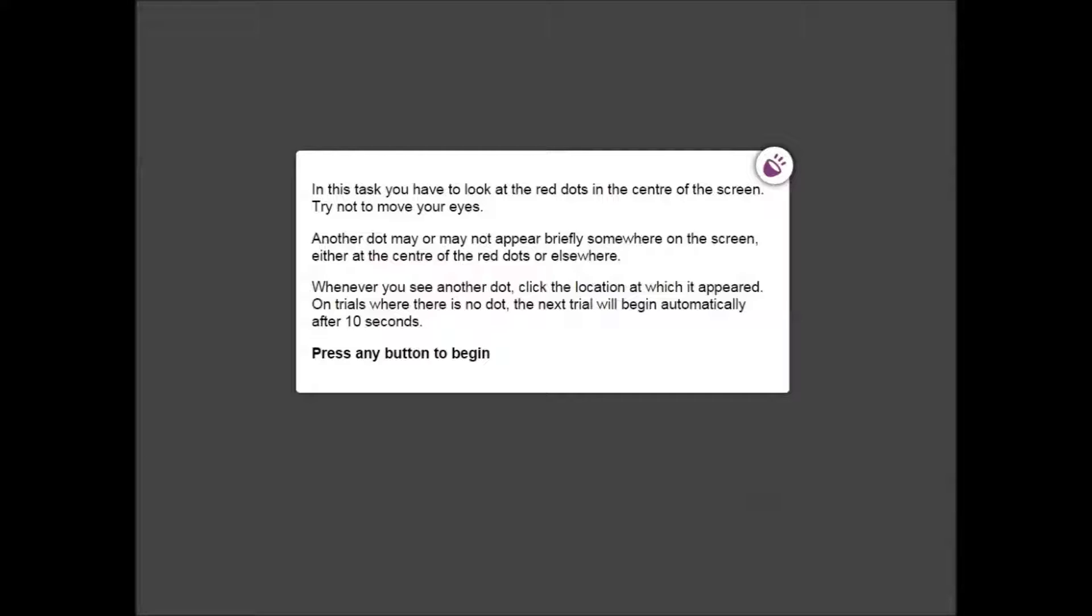During this assessment a white dot may or may not appear briefly somewhere on the screen, either at the centre of the red dots or somewhere else. Your objective is to click on the location of where this white dot appeared.